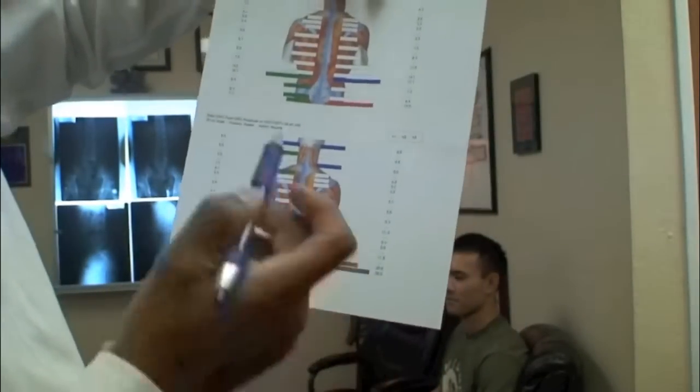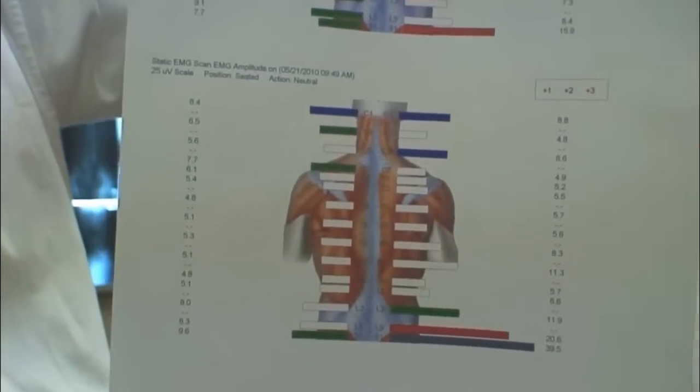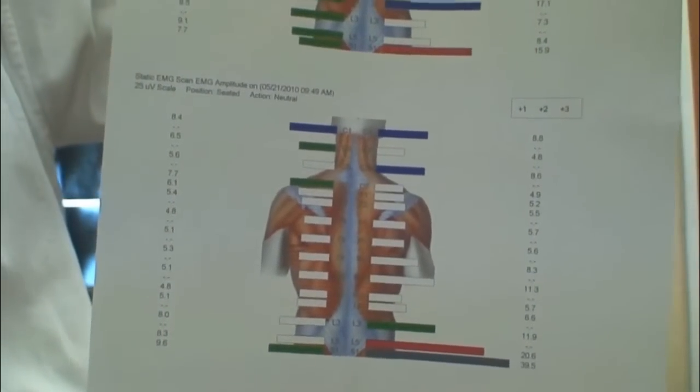Now, when Christopher came into our office, we had done initial x-rays as well, but we also did what's called an EMG test. So I'm going to go over the initial results and the present results right now. Chris is doing fantastic, but we're going to go over them. I'm going to show you the pre and post here. These are the results of 5/21/2010. In terms of muscle activity, white is normal, green is muscles that are mildly spasming, blue is moderate, and red and black are severe.